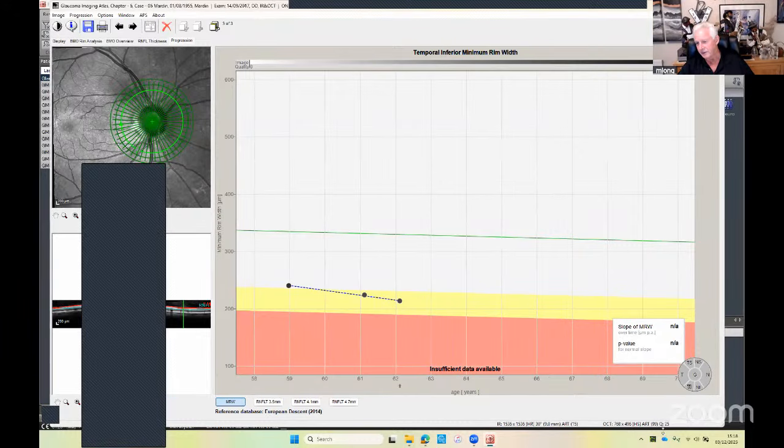Can you see right down here? We've got a quality of 25, in the bottom right corner, where my cursor is. We consider a high quality image to be 30 or over. So it's a little bit lower than the best quality, but maybe that's the best you can get depending on what the patient's eye is like. He may have cataract, he may have some other disruptions which reduce the quality. It may be the best you can get, but at least you get some indication.